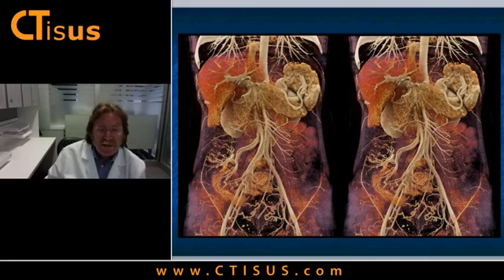We are looking at using things like cinematic as part of the ways of looking at texture of organs. One of the things you can see on the images in front of you, when you look at the pancreas, spleen, or liver, you do get a feel of the texture, particularly pancreas and spleen, and I can accentuate the images. So the question is, do I have some sort of way of looking at these and then really understanding specifically what I have in terms of texture?